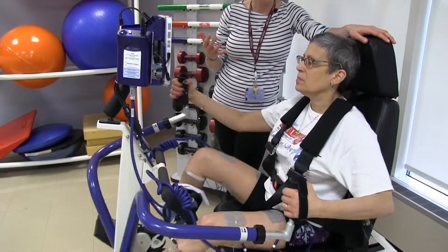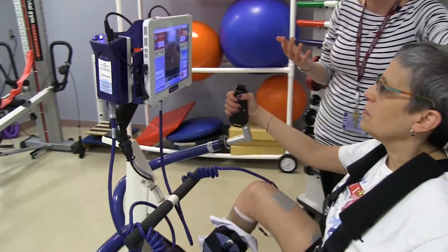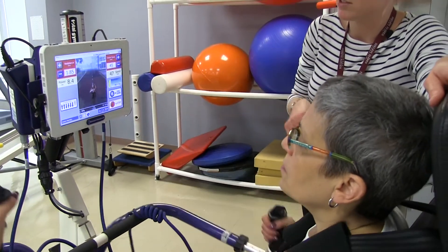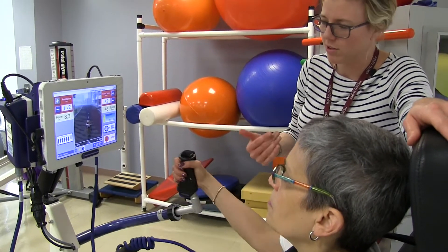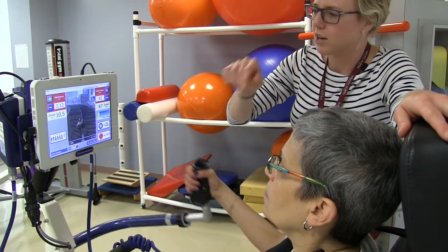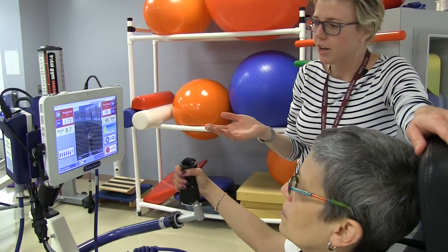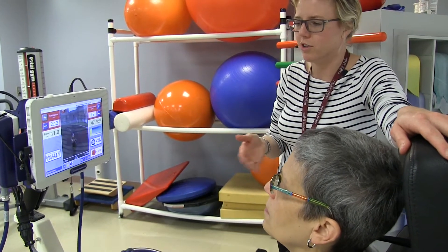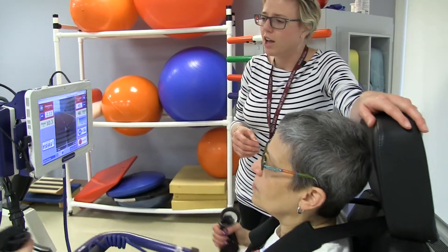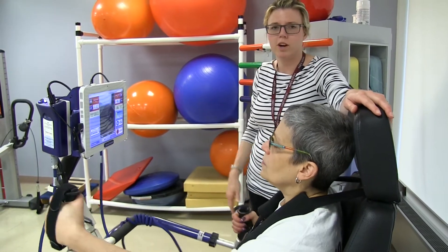You can use it for muscle training, but also you can use it for cardiovascular conditioning. Beth is given feedback in regards to symmetry of the device from her right to left side, as she does have some asymmetry. It also provides her feedback in regards to her overall speed and the power output. As a therapist, you're allowed to modify her parameters and you can continually challenge patients by adding interval training. Here at the hospital we also use it as part of our wellness program, so it's something she could work on individually.